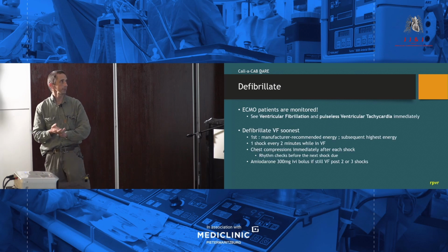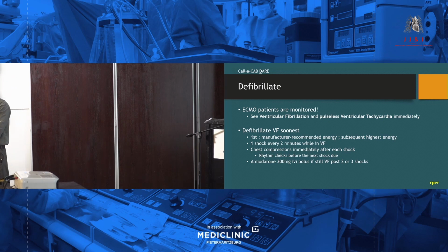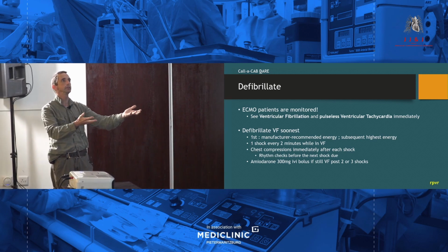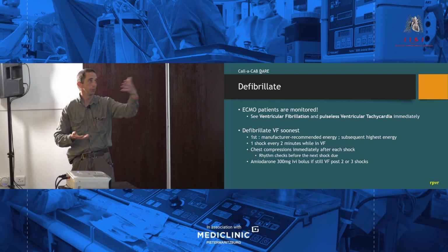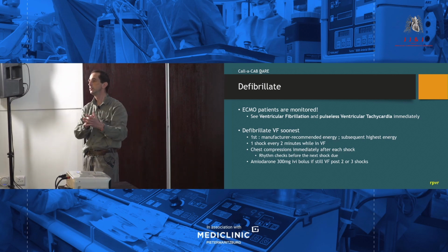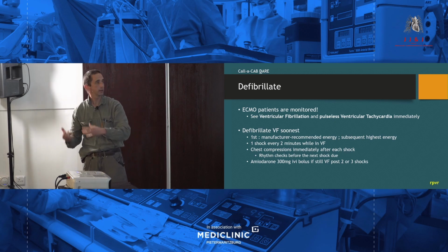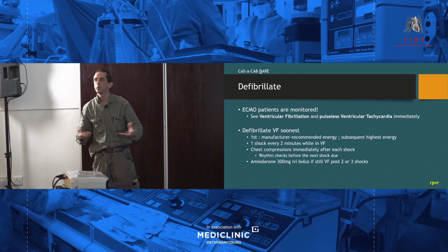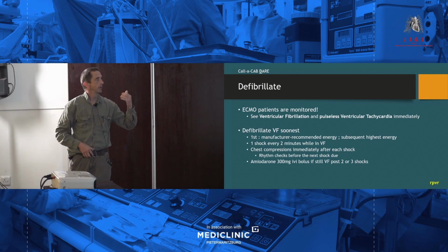Okay, next one, please. Defibrillation is an absolutely essential thing. Now, the good thing again about ICU patients is that they'll be on an ECG, and straight away, as soon as you see the arrest, you should be looking up, and if you see they're in ventricular fibrillation or pulseless ventricular tachycardia, you know there's no cardiac output because the heart is just quivering, and you all know the immediate thing is to defibrillate them as soon as you possibly can. Hopefully you've already got stuck on pads and don't have to use paddles.